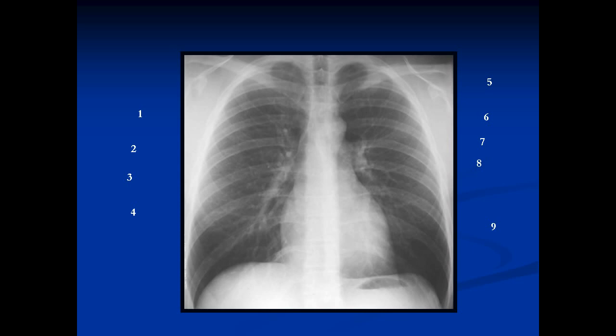We're going to start with the PA view of the chest, and the first structure we're going to talk about is the superior vena cava. There's an interface here — a line you can see adjacent to the mediastinum. On one side of the line is white, on the other side is black. The reason we see this line is because it's an interface between air and soft tissue. If there's no air next to the mediastinum, we will not see the structure. This line comes all the way down from the neck, right to the region of the right atrium, and that line is formed by the superior vena cava.